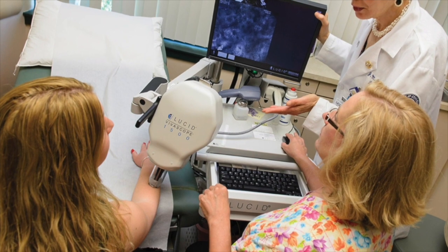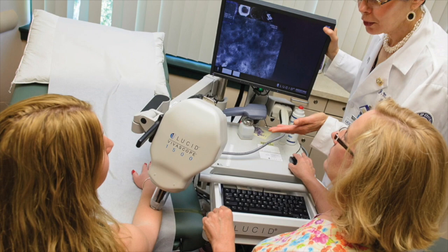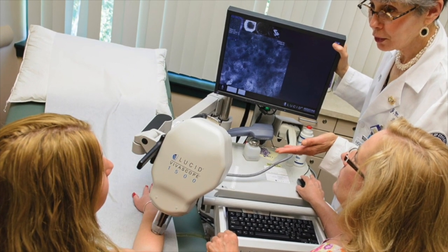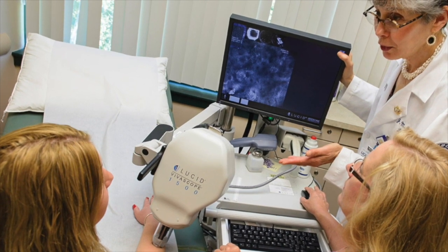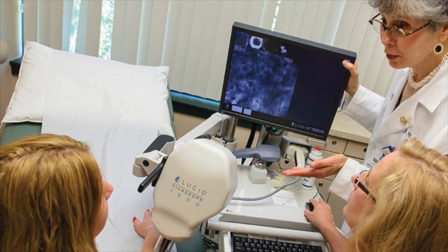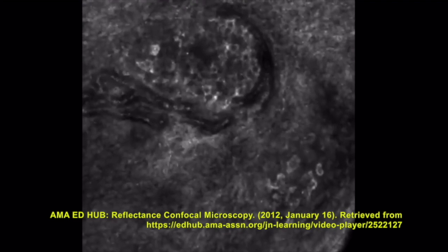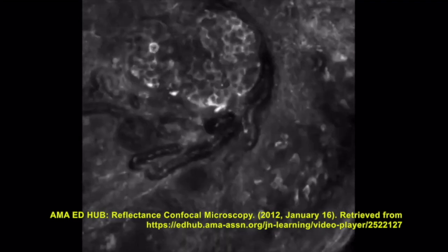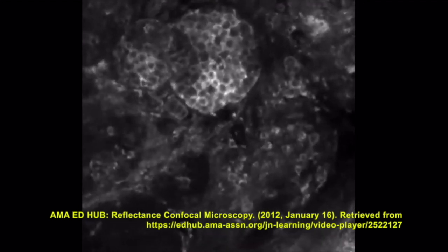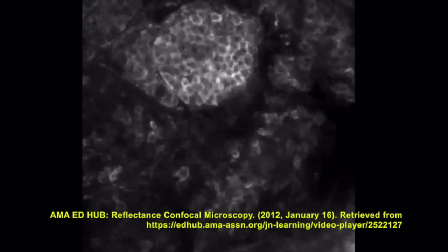The Reflectance Confocal Microscope has many advantages. It is a reliable alternative for a non-invasive technique and allows for investigation of normal to pathophysiological processes with high microscopic resolution that can be viewed in detail. If we combine the Reflectance Confocal Microscope with other non-invasive technologies, for example ultrasound or MRI, it can improve resolution and details. There are still some adjustments that need to be made for future use, but once they are done, it can be a better alternative for imaging skin for clinical use.